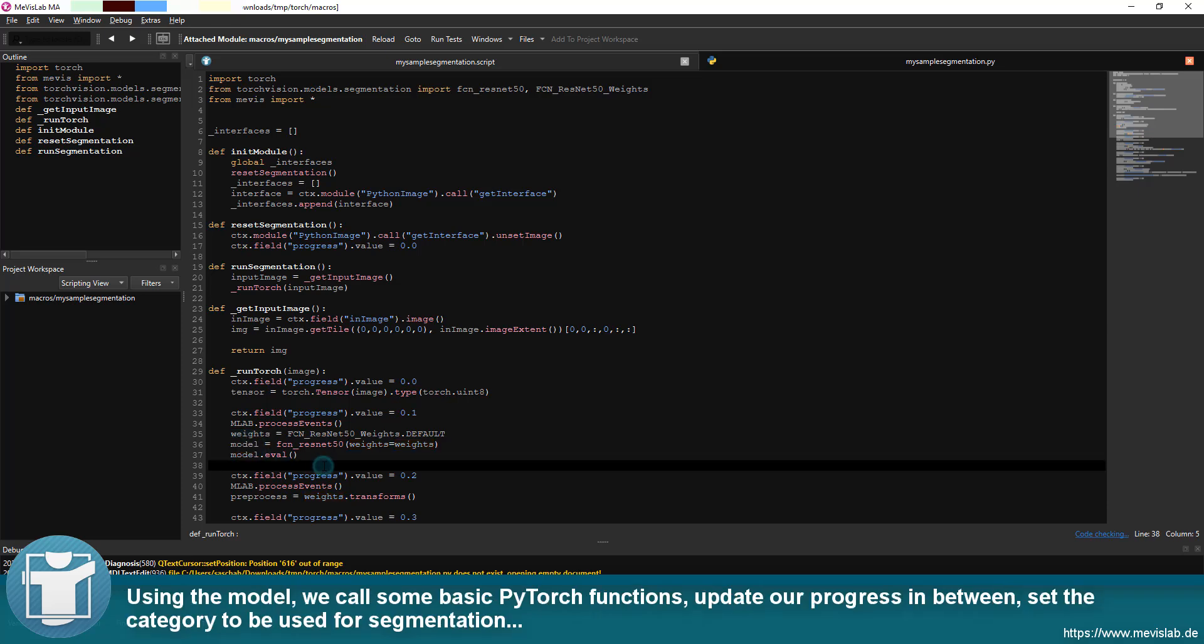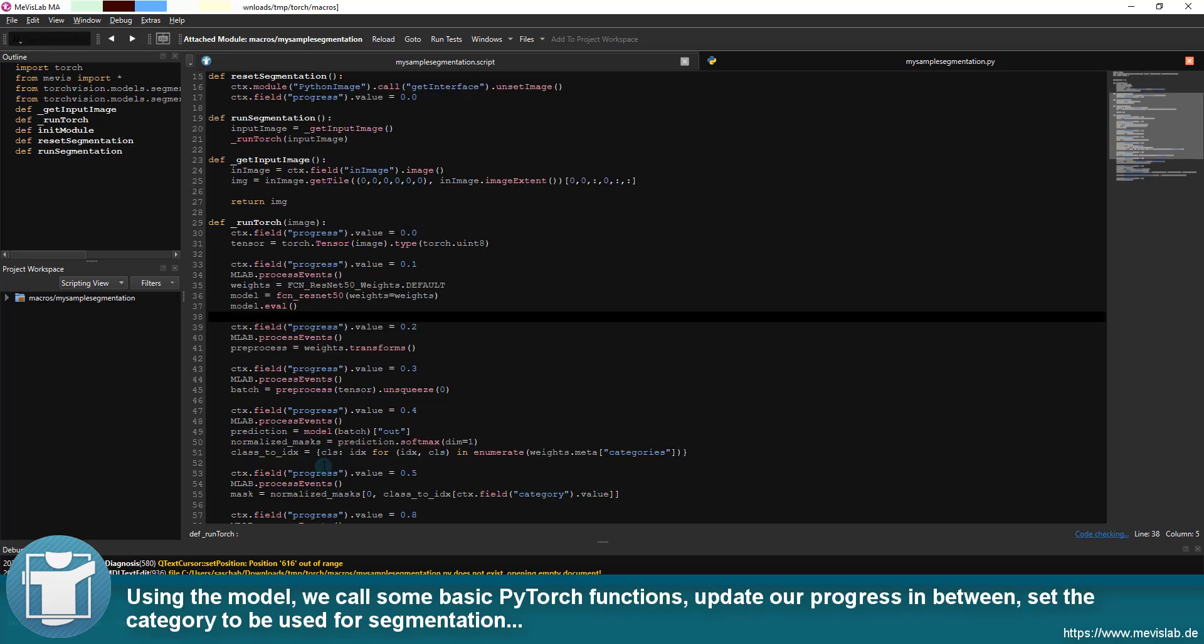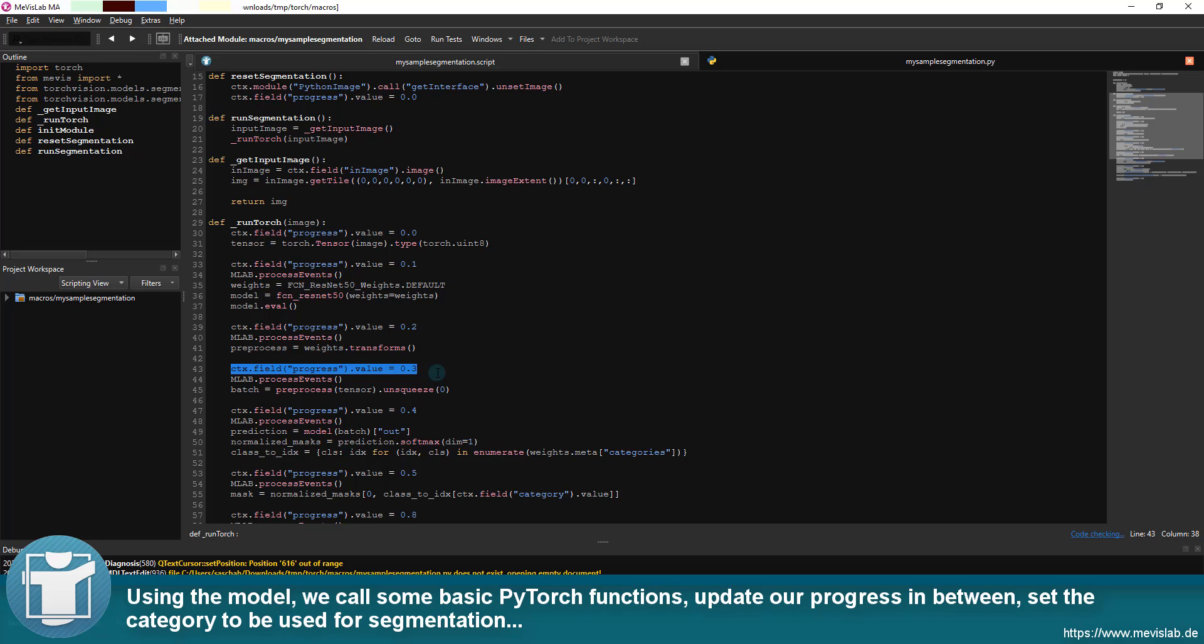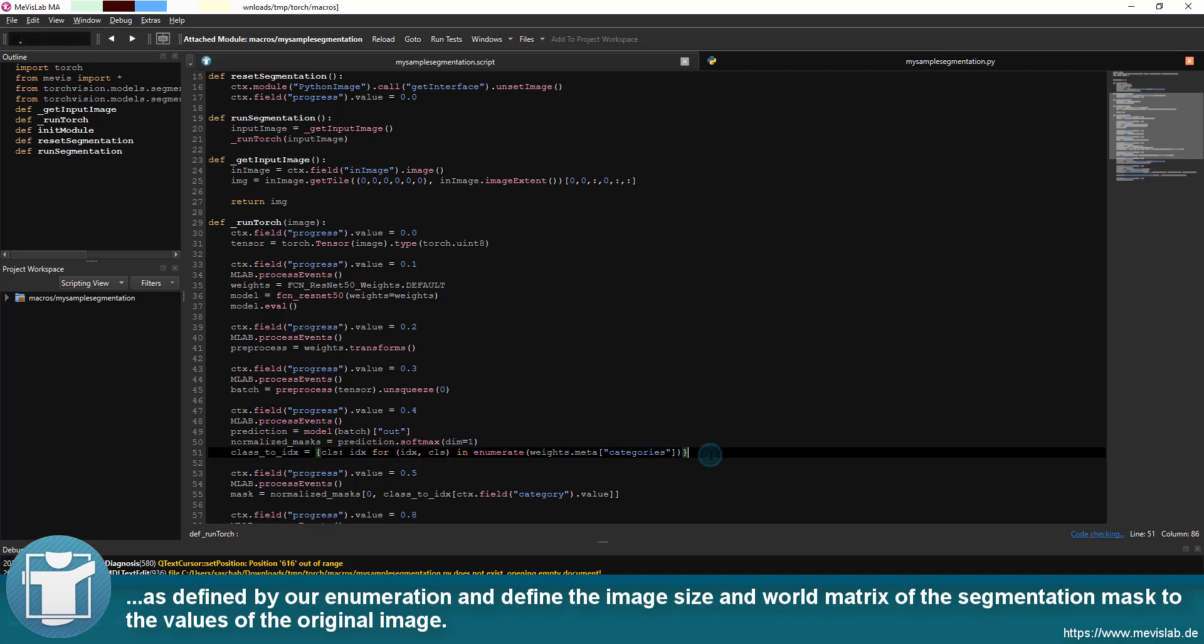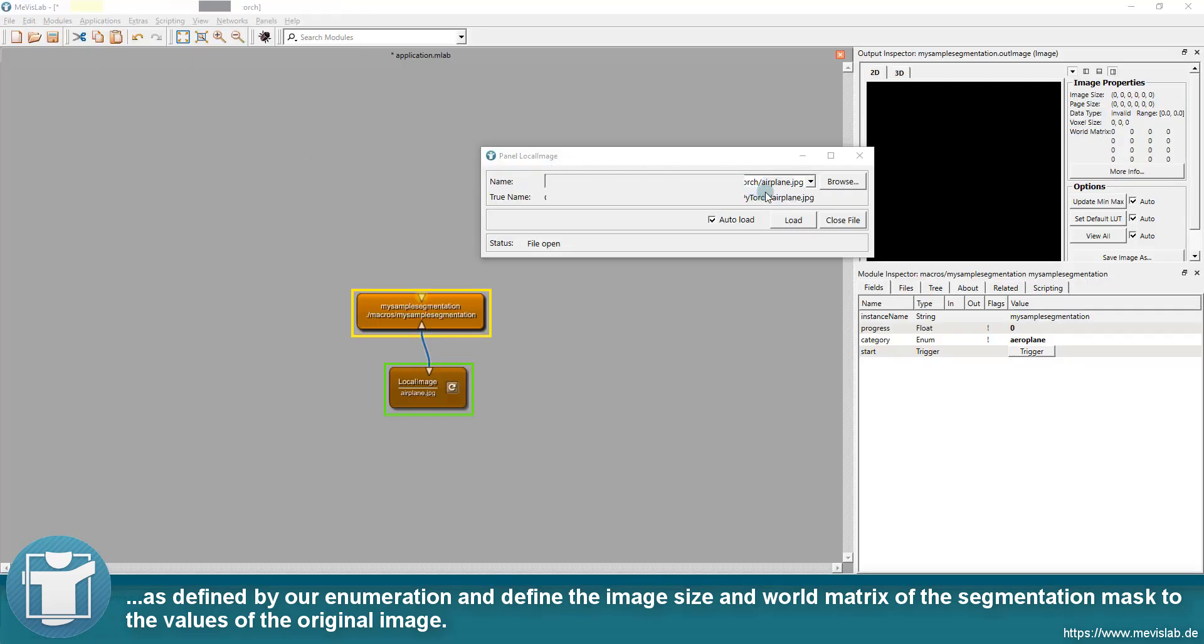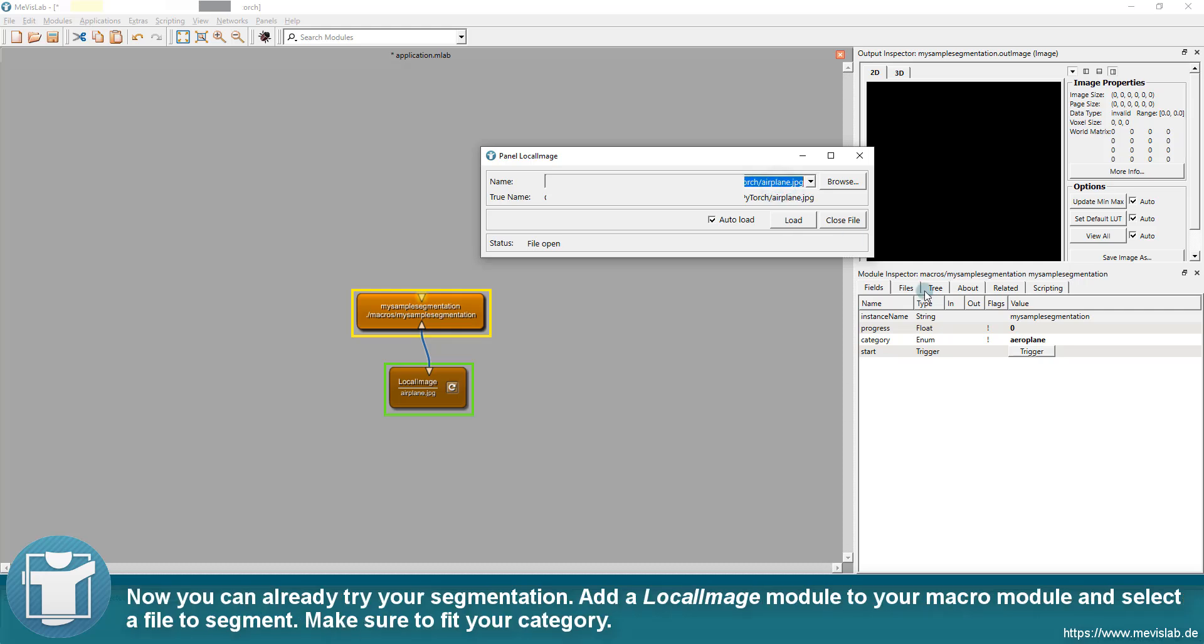Update our progress in between, set the category to be used for segmentation as defined by our enumeration and define the image size and world matrix of the segmentation mask to the values of the original image. Now you can already try your segmentation.